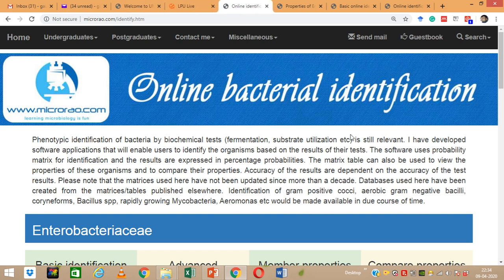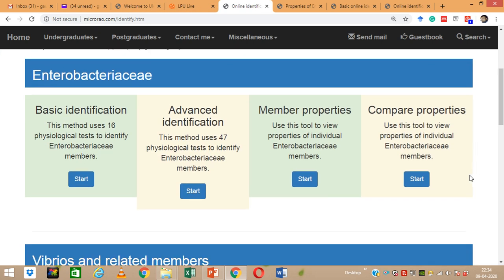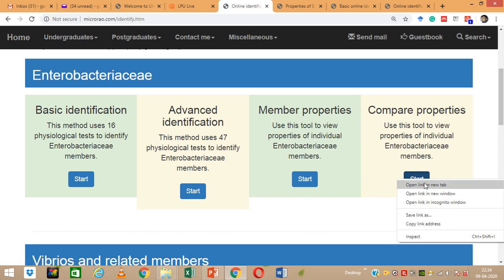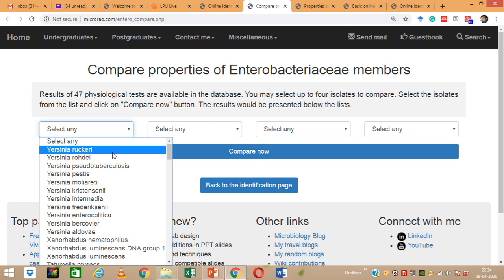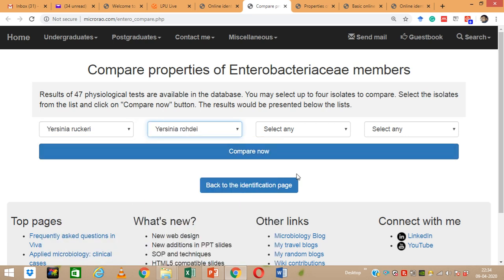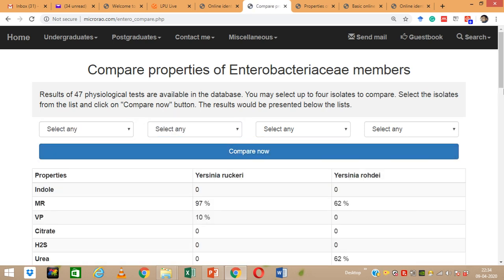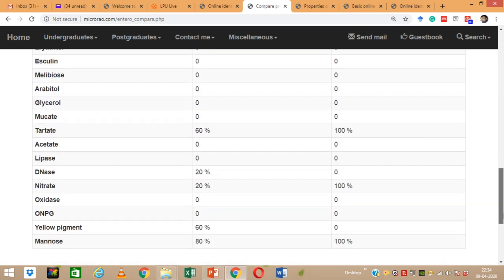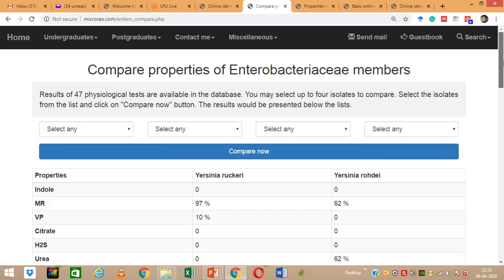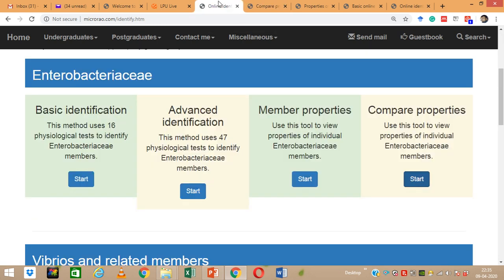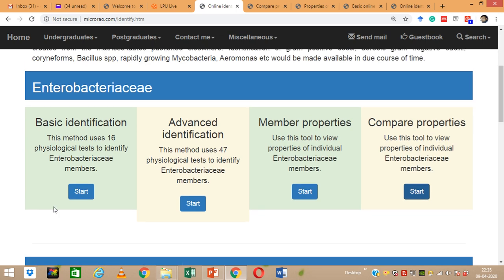The next option is Compare Properties. Here we can select two organisms to compare, click Compare, and get a table showing the differences between those two organisms. So there are four major options: the first two are related to identification of the organism, while the other two are related to viewing and comparing properties of microorganisms already in the database.